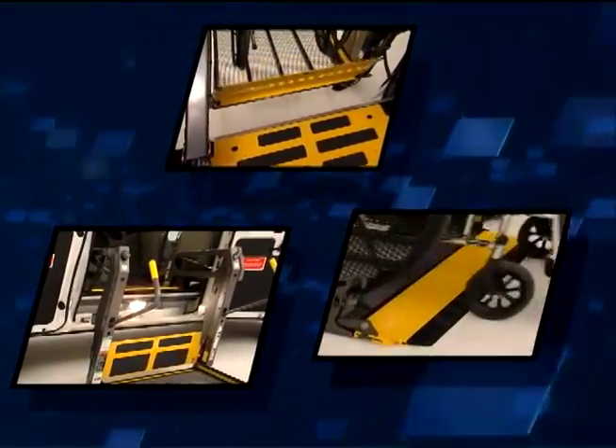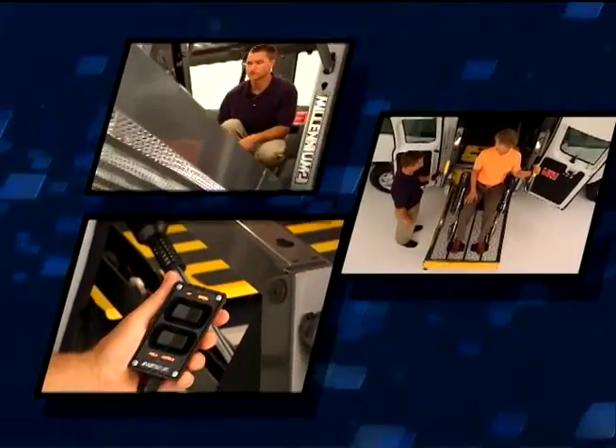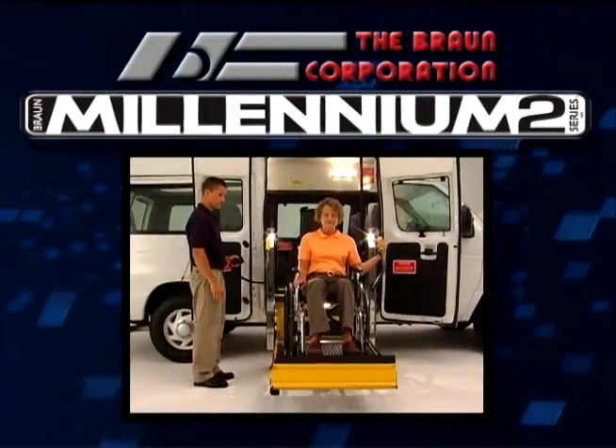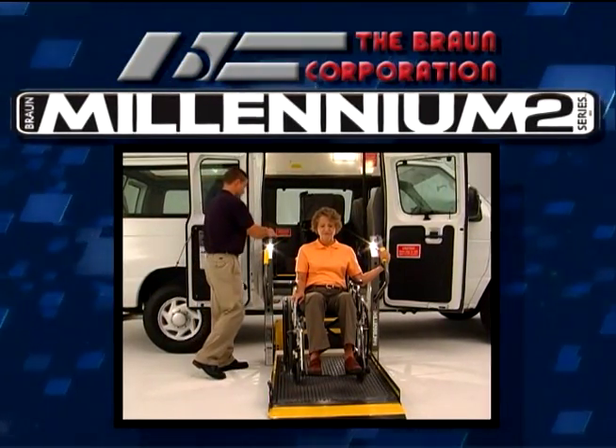Welcome to the worldwide family of Braun lift owners. We created this program to help you get the most out of your Braun Millennium Wheelchair Lift. Over the next few minutes, we'll highlight the operation of the lift and offer tips on basic maintenance.